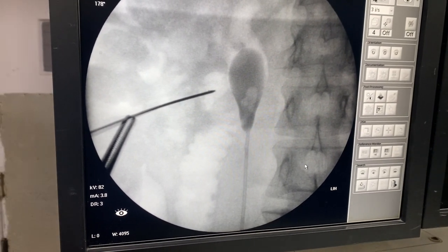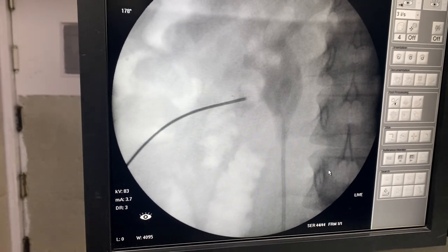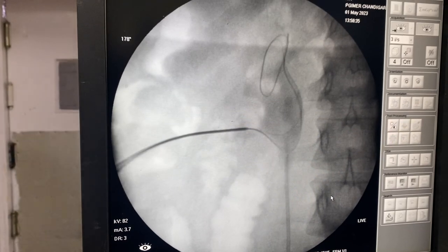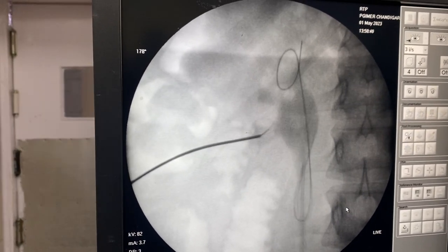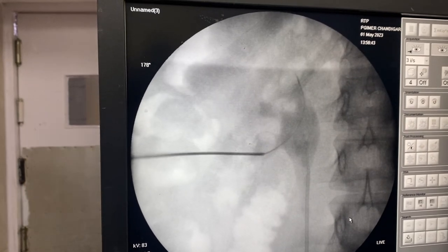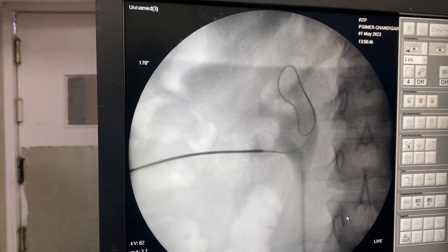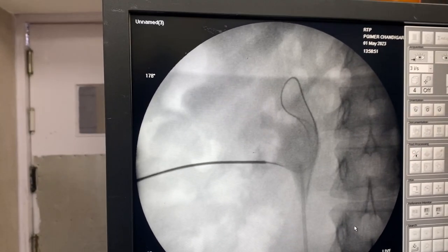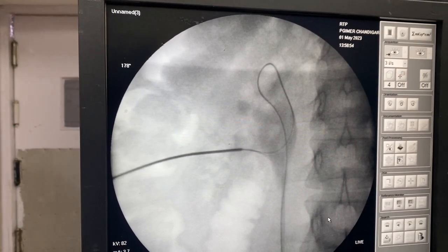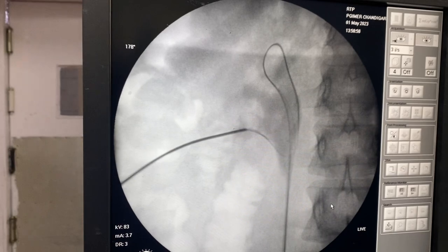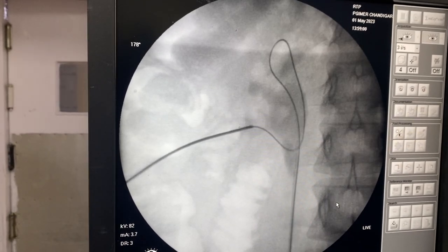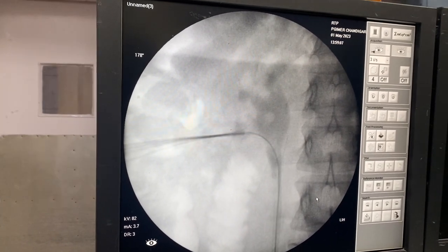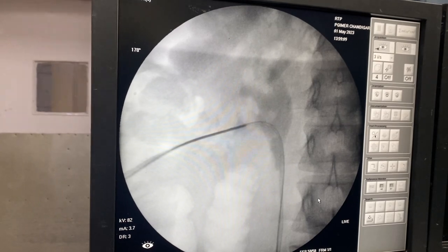Now I will be passing a guide wire into the system. You can see the guide wire initially coiling in the pelvis, and you can see the stone also moving inside. I always try to pass the guide wire so that it goes into the ureter — you should make a genuine attempt for that. After manipulation, you can see it has gone into the ureter. I then pull the guide wire and keep it straight into the upper ureter, making the track straight.